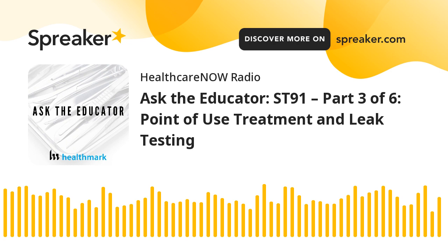Yeah, so let's get into the communication part of the handoff, because I like the change, right? It's not just pre-cleaning, that's a part of it, but there's a lot of point of use things that need to get done. So point of use treatment is actually a better terminology to encompass all those things. But talk a little bit about that communication, that handoff between the endoscopy room and then moving into the decontamination area. Right. So historically, it did not routinely exist.